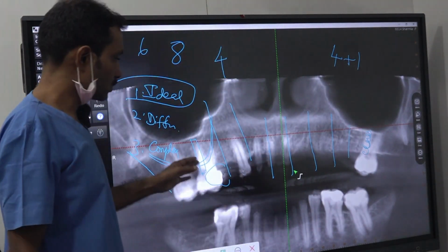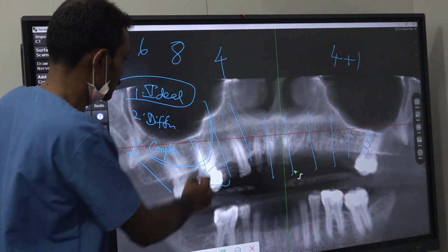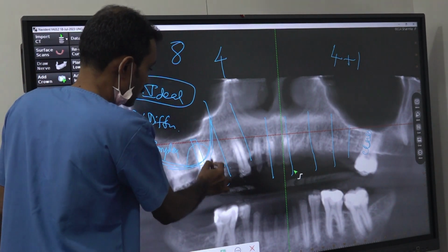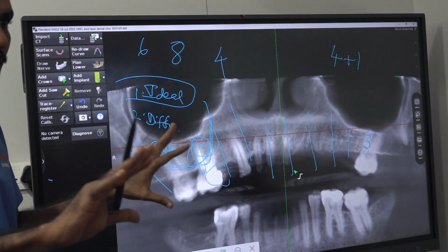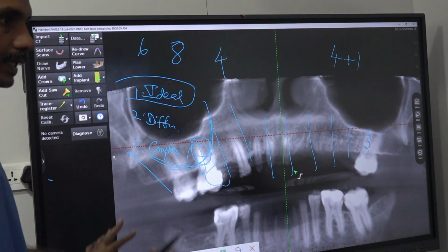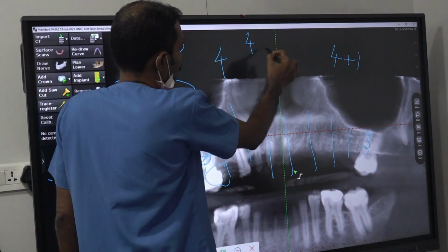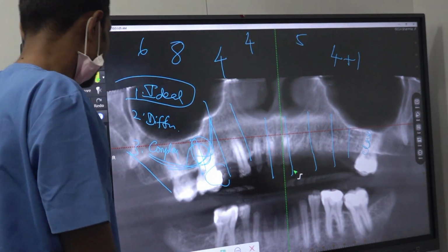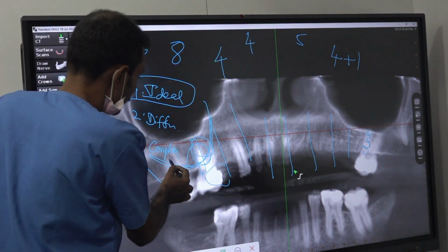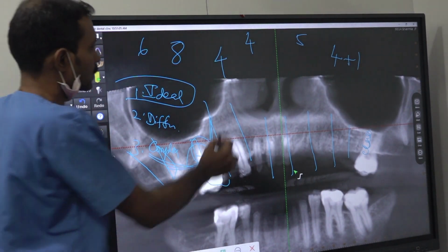But many times there is no bone in the molar, right? The sinus is expanded or there is crestal bone loss. By seeing the panoramic X-ray, you are making one simple plan. That is the beginning stage of the plan. So out of this plan, right side 4 implants, left side 5 implants. Even you can place 1 more implant in the 7 region. 5 plus 5.